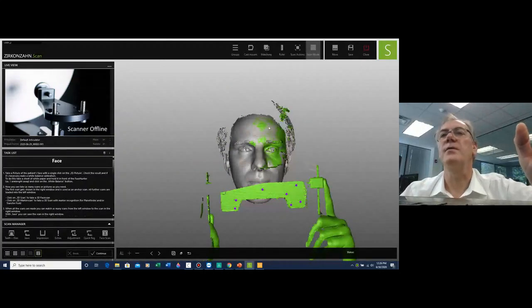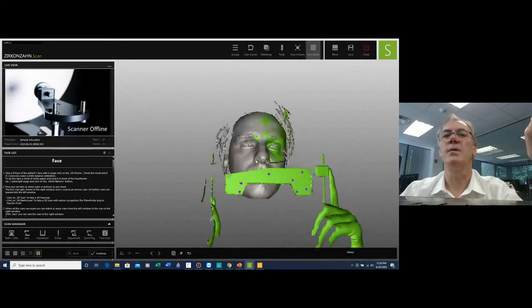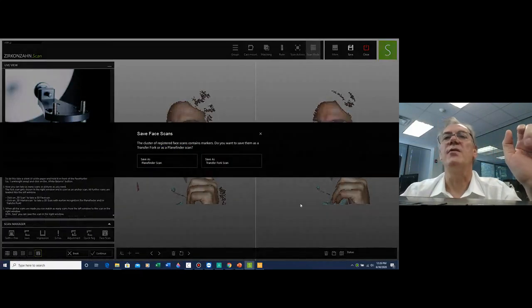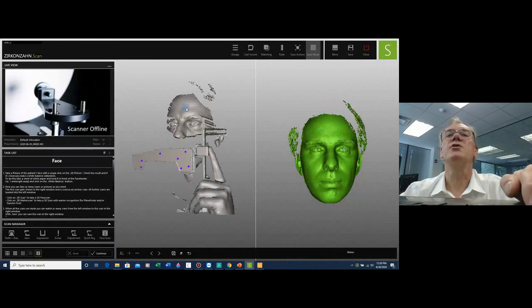Again, we look at the area of the forehead. This is matched pretty well. We can take it down from the bottom and see that more or less it is aligning with what we had while we were taking these pictures. And we are going to utilize 2 or 3 of these images that we've taken just to have an average of every time the patient walked up and walked out from the position in the plane finder. And the computer will generate an actual average between every time we took the image.